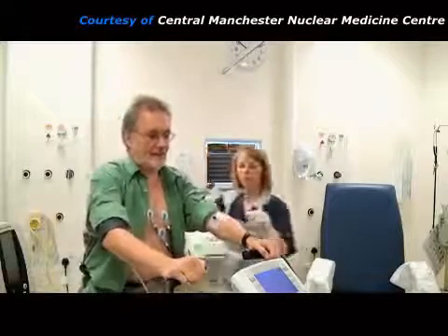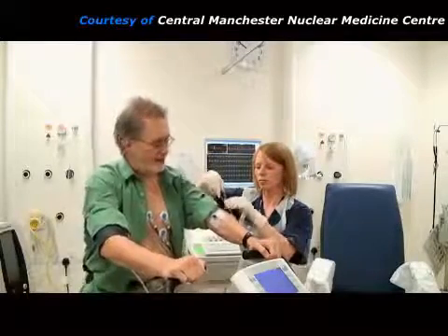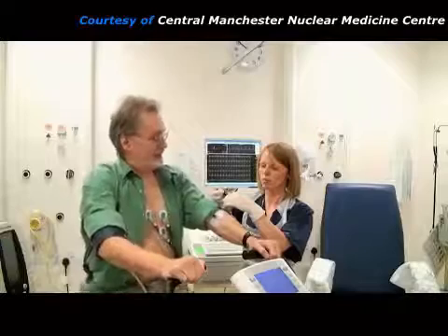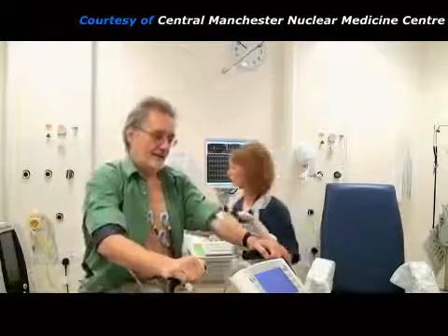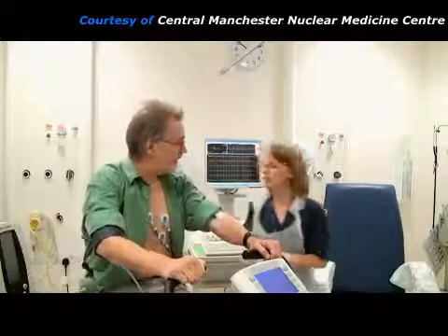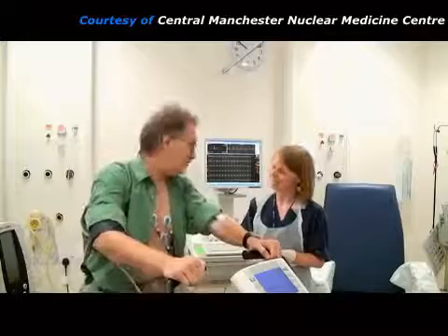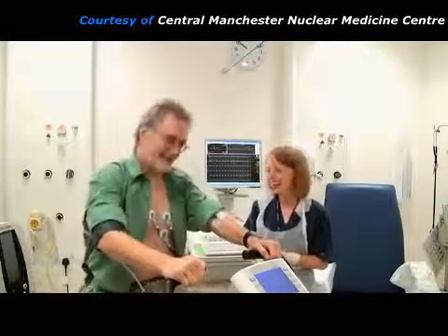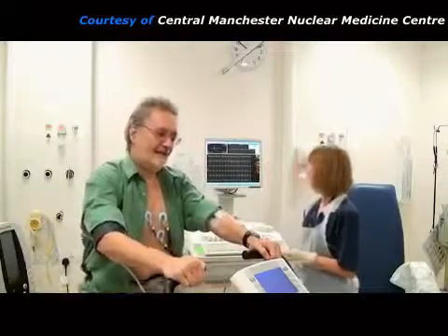When the patient has exercised to near their limit, the practitioner injects a radioactive chemical called a radiopharmaceutical through the needle previously placed in their arm. As soon as it is injected, the radiopharmaceutical goes to the heart muscle to reflect the myocardial blood flow at this moment of maximum stress. The patient must continue to exercise for a further 2 minutes and then they can relax.